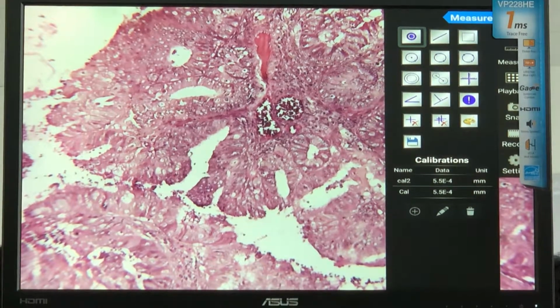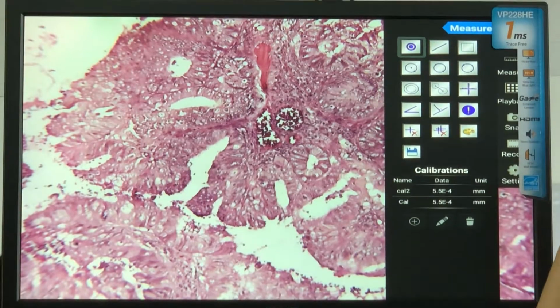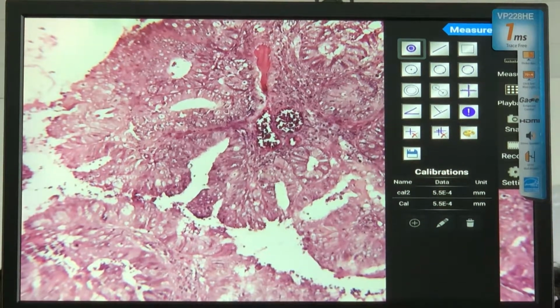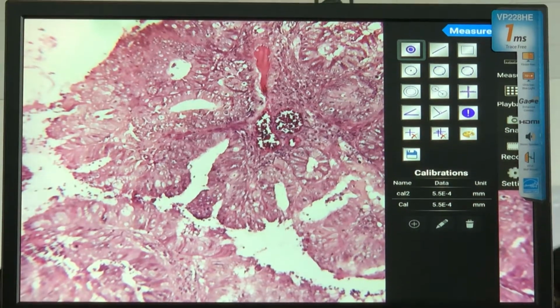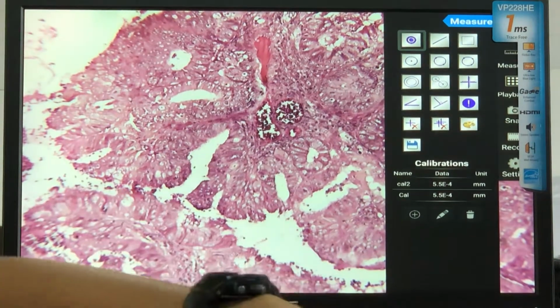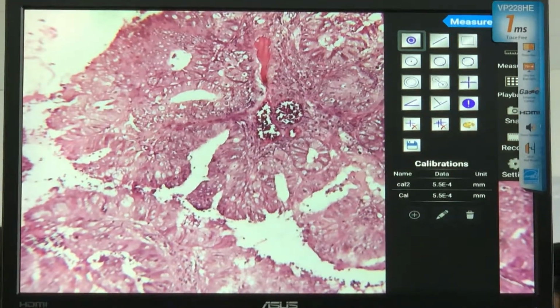However, epithelium does not have hyperplasia. So this is an endometrial gland, and endometrial gland could undergo adaptive changes of hyperplasia. Granting without atypia. If with atypia, it would be prone to cancer formation. So later in neoplasia, I will show you atypia. Right now, it's not suitable because in here, actually I saw atypia, but I will not point to you so that you will not be in doubt or confused. With atypia, we reserve that when we go to neoplasia.